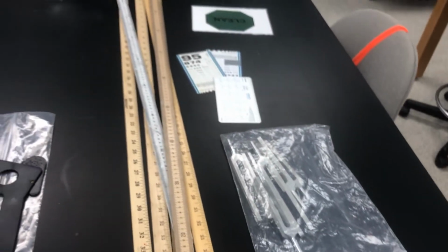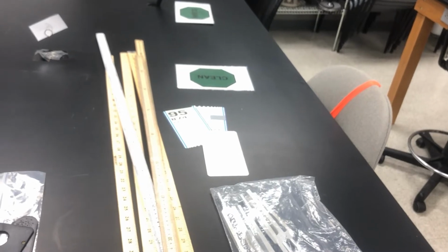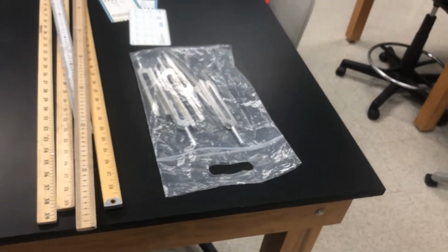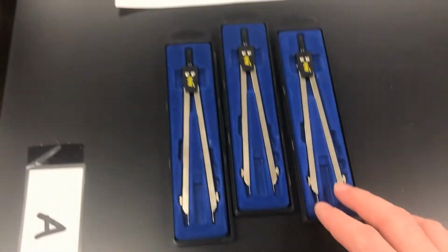just use your heel. You want to listen for the low sound. You want to hear the low sound. You're going to do bone conduction with this, one side or another. Rinne's and Weber's test, really powerful tests for diagnosing different types of hearing disorders. We often will do localization of sound, but we're not doing that this semester. So we're going to be doing Rinne's and Weber's tests, a very common clinical test.